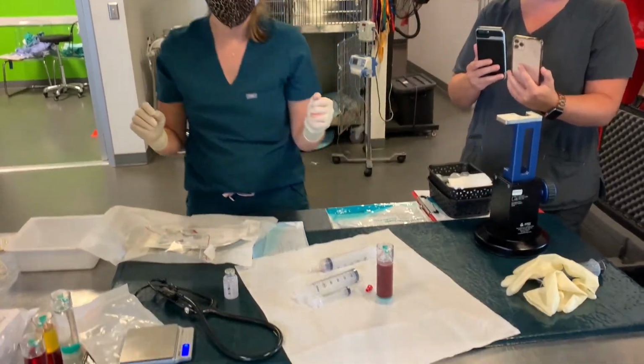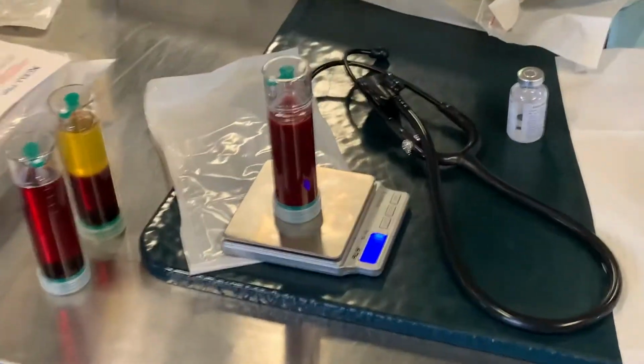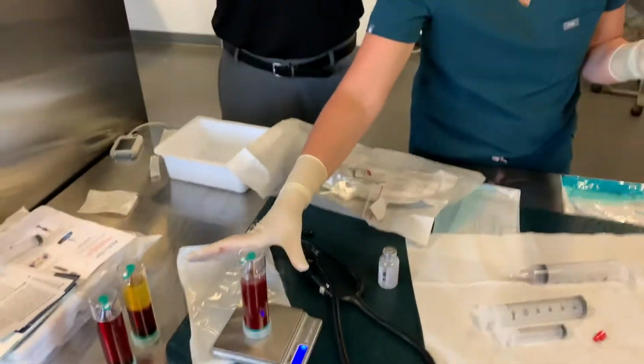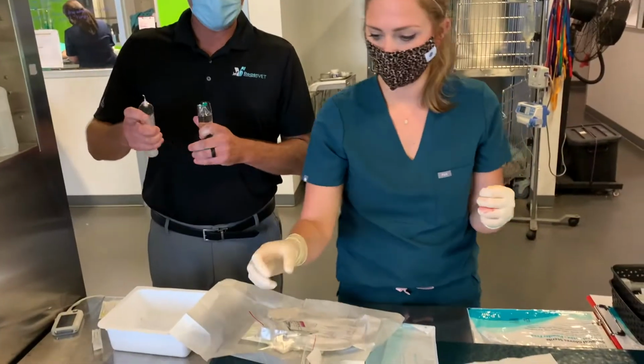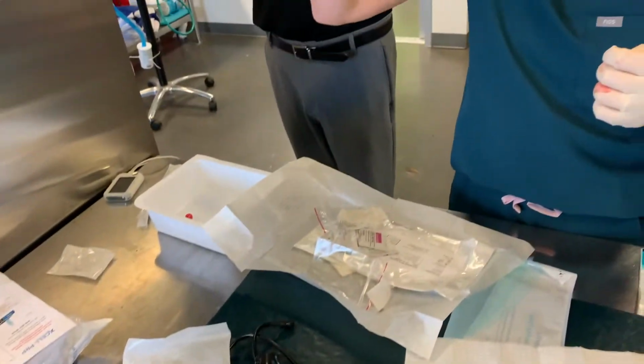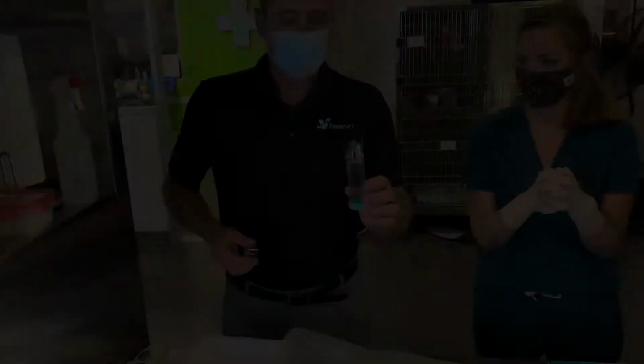And then you weigh it. And then we'll weigh it. And it's 96, I assume that's grams. Yep. So, perfect, 96. And then roughly how many mLs do you see in there? It's 51. Yeah.